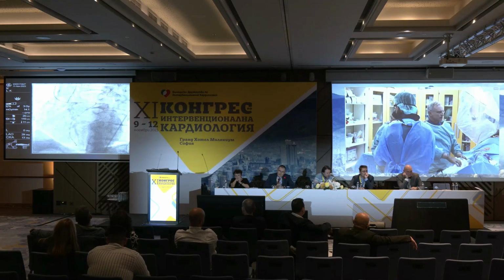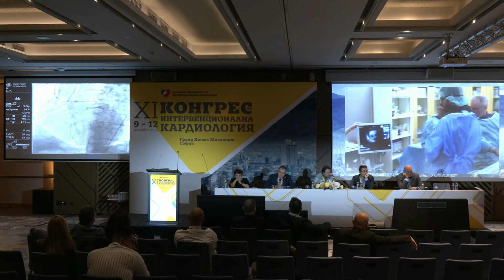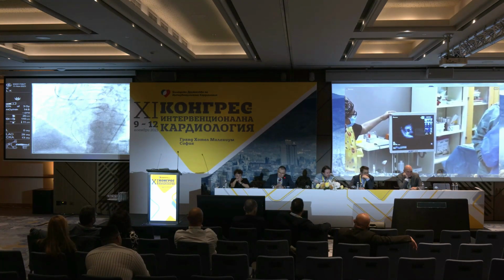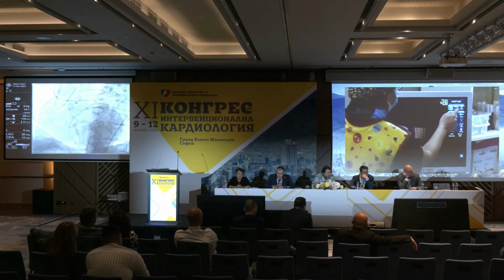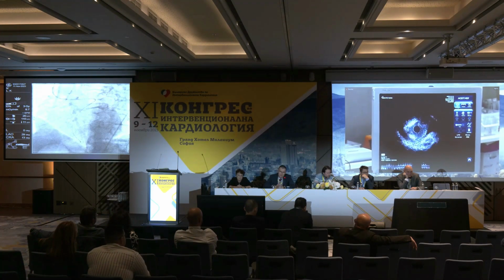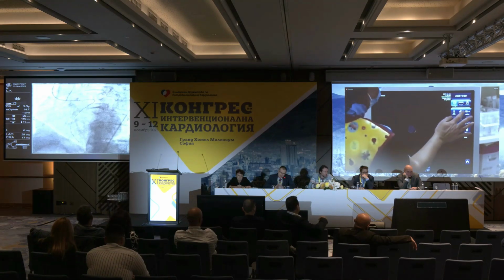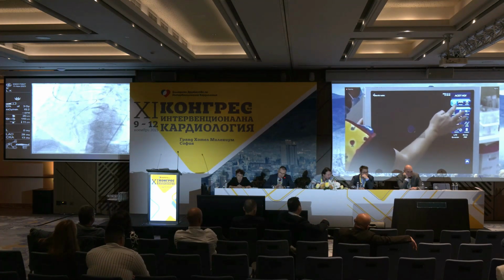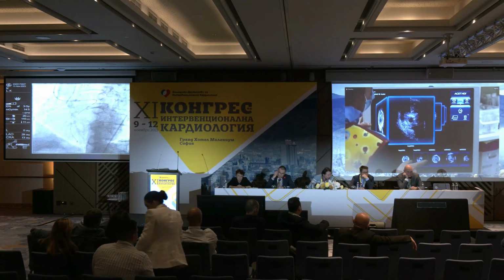So I'm pulling back just to evaluate the ostium now. Can we see the ostium? Yeah, that's exactly what I want to do. It's a very diseased ostium. Let's flush the catheter a little bit. You will see it now. There is a severe stenosis. See the ostium there? Yes. I'm sorry that the catheter is jumping in and out because I took the amplats. Let me correct the guiding a little bit. If I correct the guiding, it will be more stable.